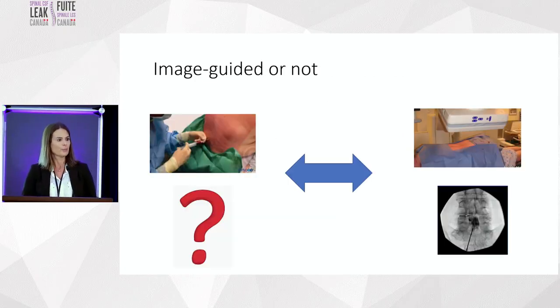Epidural blood patches can be performed without image guidance. It's a more classic approach amongst us anesthesiologists, or can be done under X-ray or CT guidance, which allows, in that case, for injection of contrast and confirmation that the blood is actually in the epidural space as well as spread. At the same time, we can also target the blood more to a certain level, which is not the case when we do a blind or a non-image guided approach.